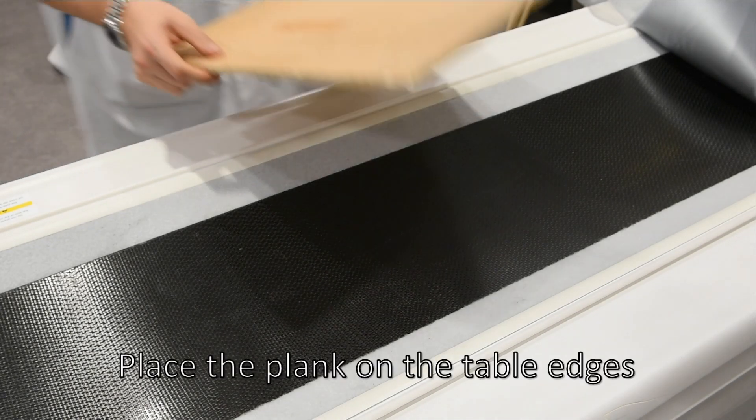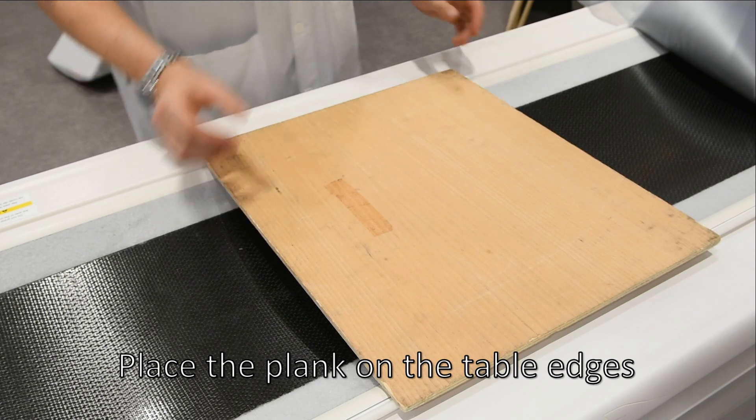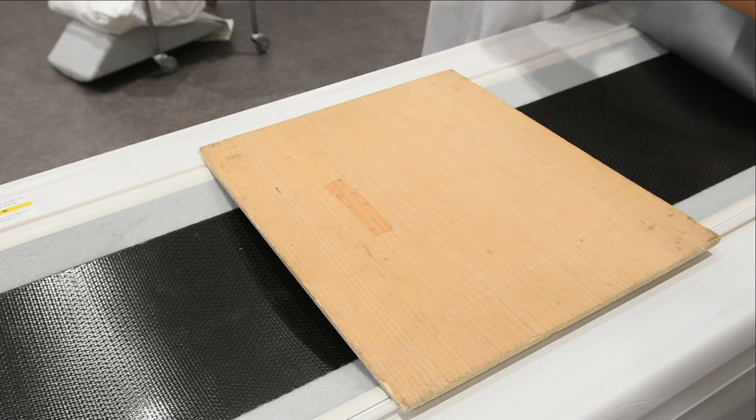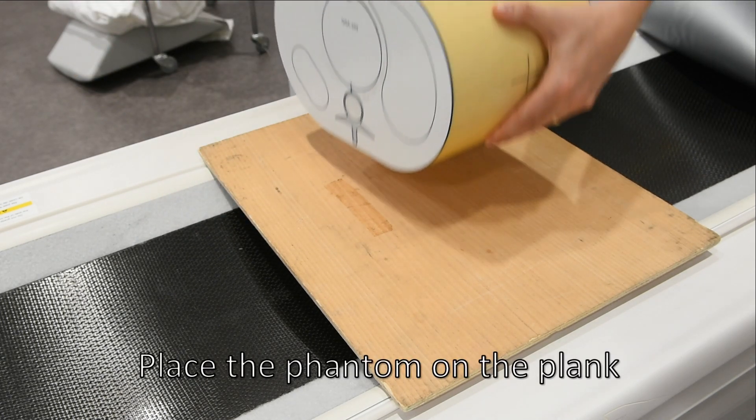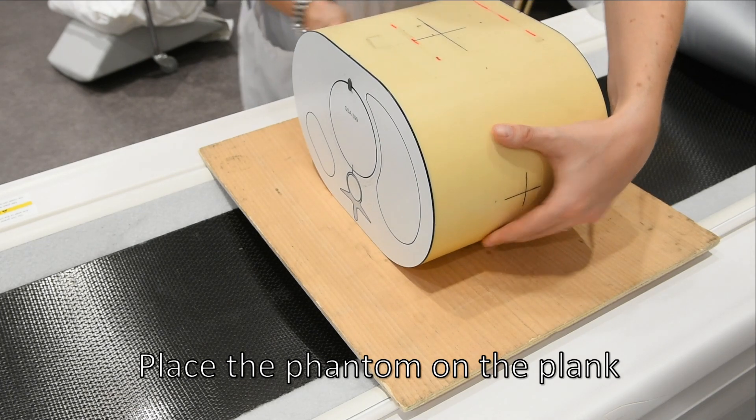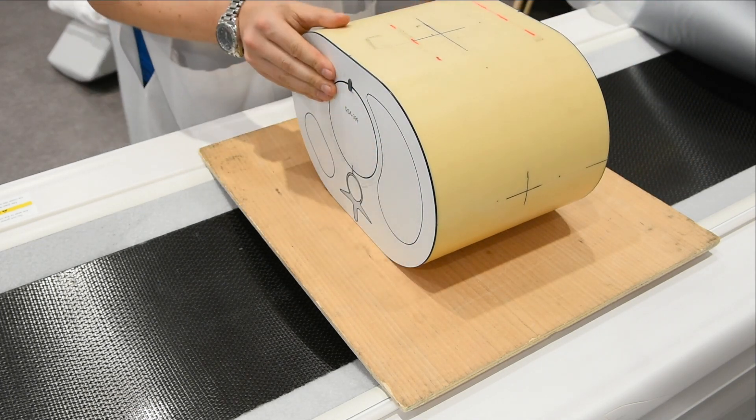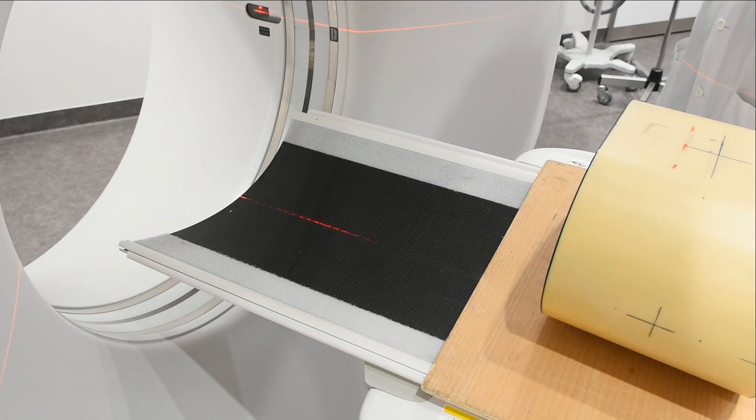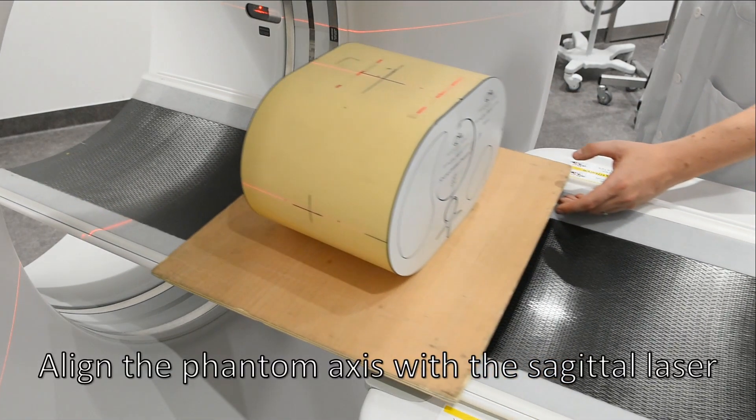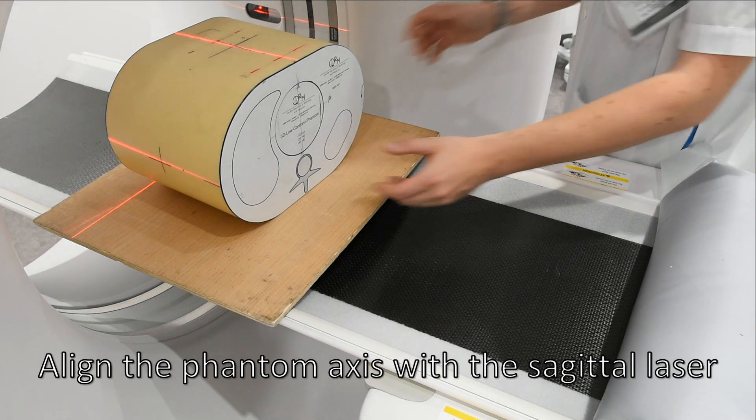Place the plank on the table edges. Place the phantom on the plank. Align the phantom axis with the sagittal laser.